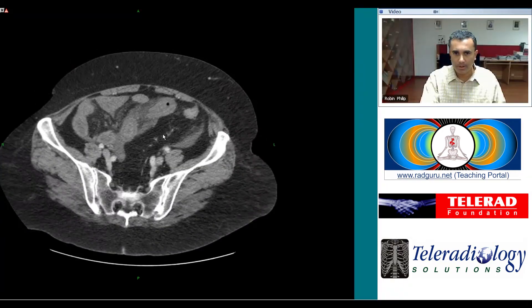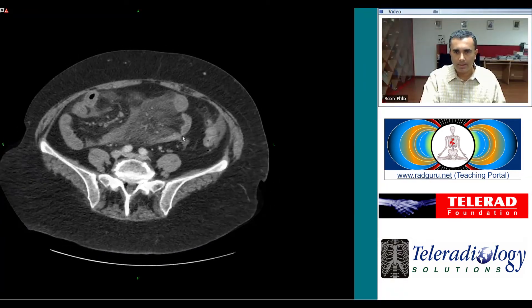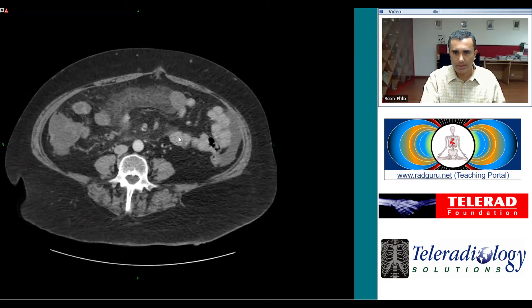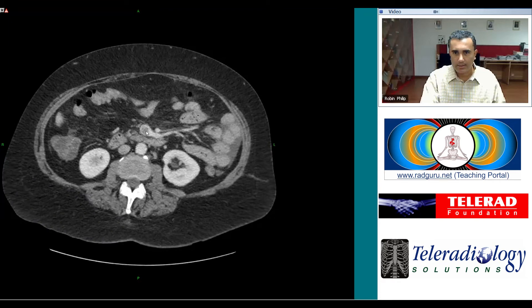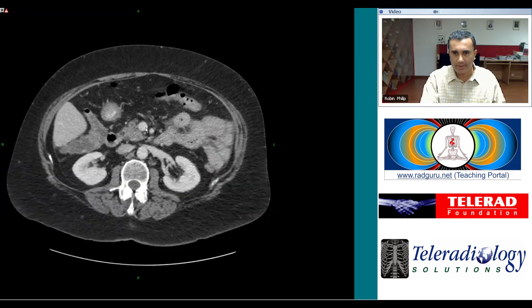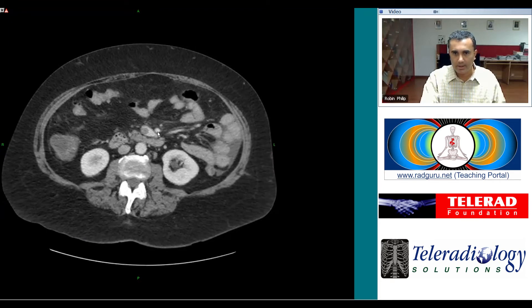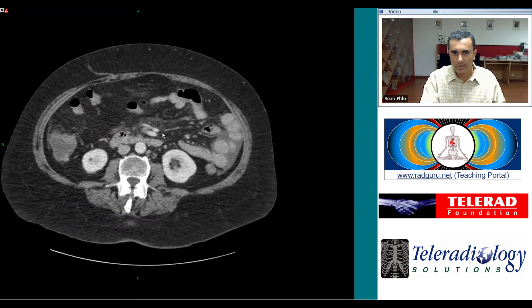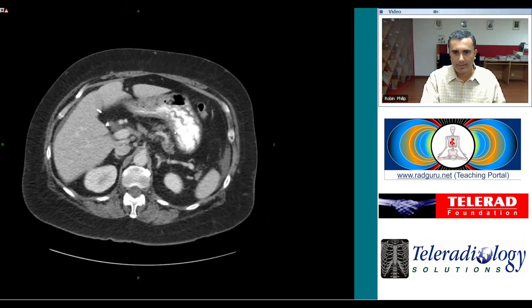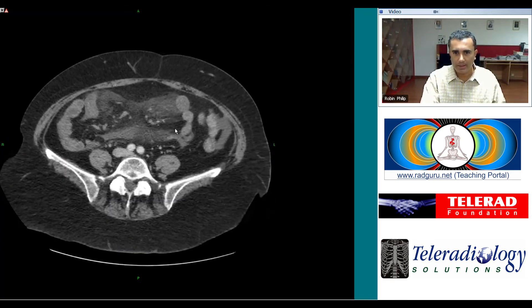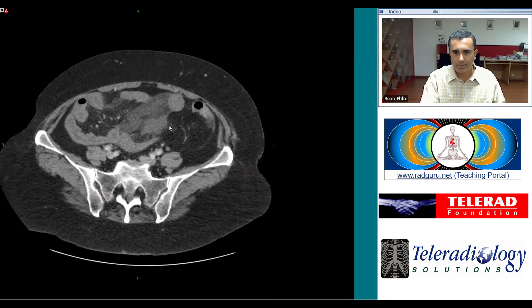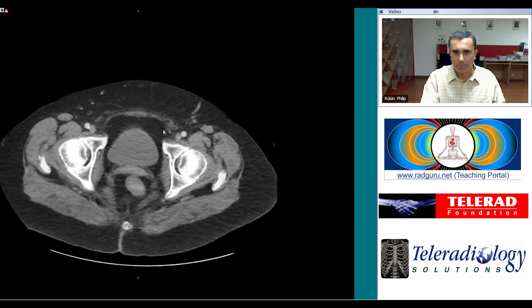This involves a longish segment of the small bowel in its mid portion. When we look a little bit closer, we see another interesting finding: the superior mesenteric vein has a large filling defect in it which completely occludes the vein in some portions. Putting the findings together, we have ischemic bowel as a result of superior mesenteric vein thrombosis.